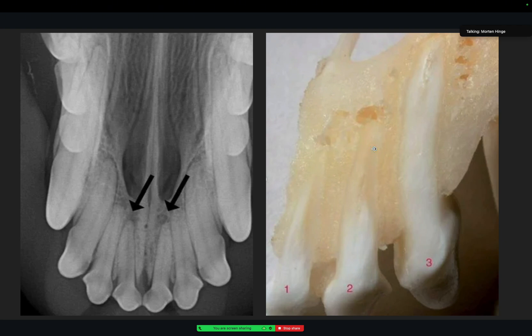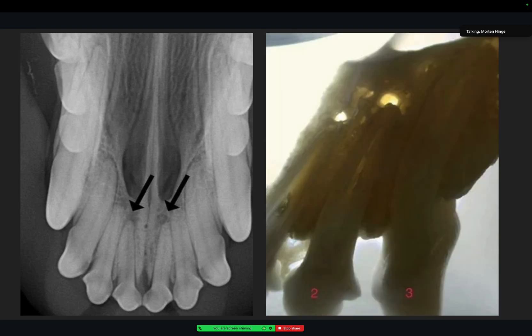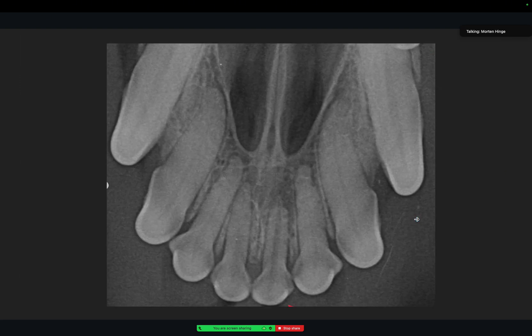This is a particular thing you have to keep in mind when evaluating incisors. When you have the backlight, you can really see the same as it would look like with an x-ray — you can see that round, loosened area that looks like an abscess. It's not; it's normal.